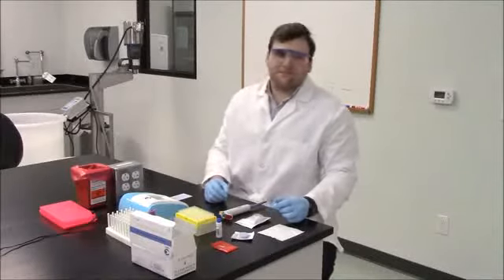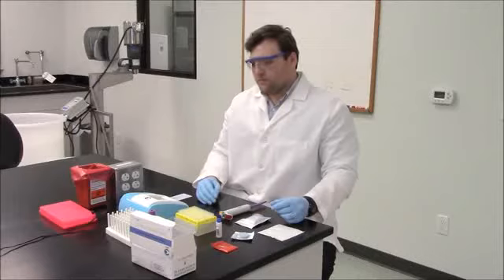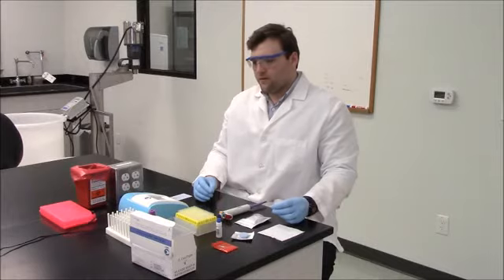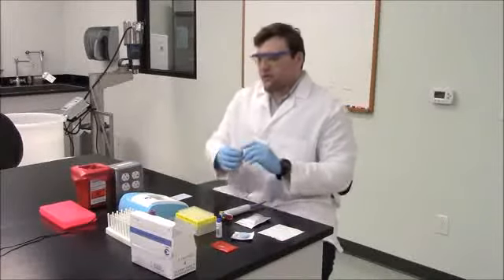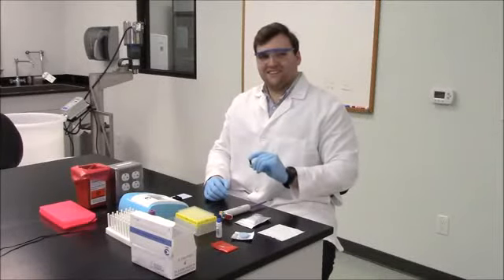After the mixture is absorbed completely, mix R2 well and apply 25 microliters of R2 to the cartridge. Don't touch the cartridge. Avoid air bubbles. After R2 is absorbed completely, test the cartridge.